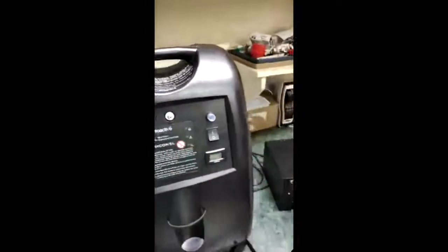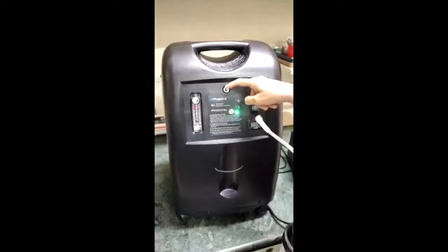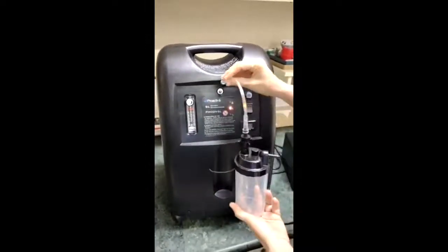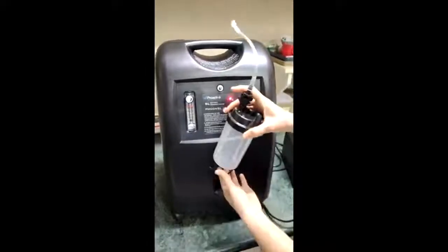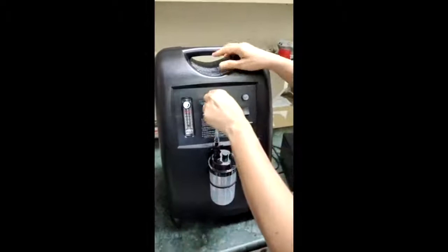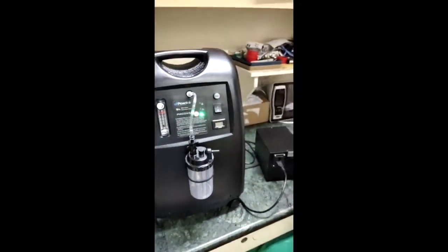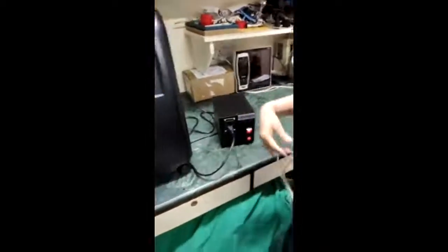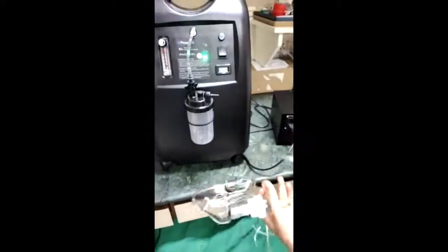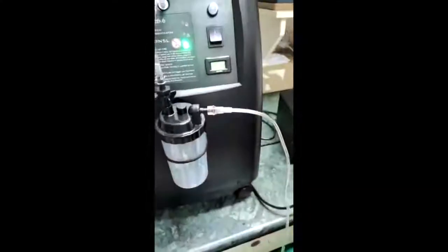This concentrator also comes with a humidifier bottle and tubing. This is the oxygen output port — the tubing attaches here and the humidifier bottle is fixed into this slot. From the bottle there is another output that goes to the patient, so the patient tubing — either through nasal prongs or a mask — is fixed on this output.